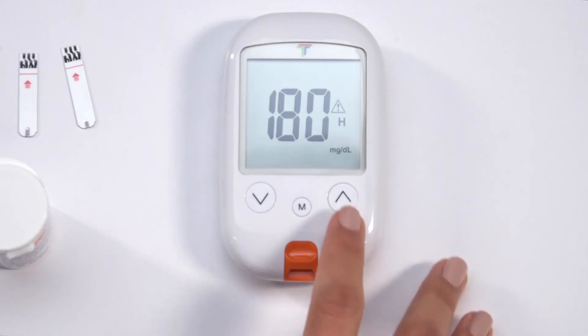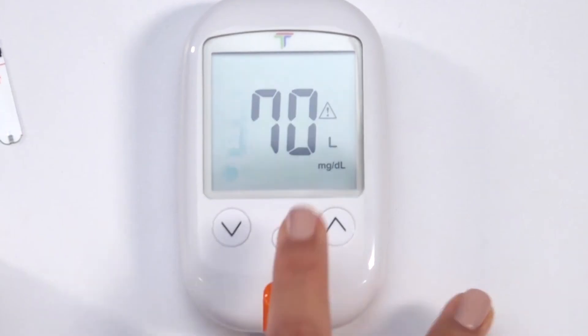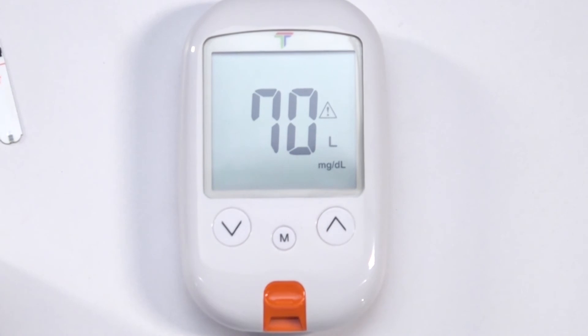You will first enter the high alert setting. Use the arrows to turn the alert on or off. If off is selected, the meter skips the high setting. If on is selected, find the desired value and press M to confirm. The default value is 180 milligrams per deciliter and ranges from 100 to 400.